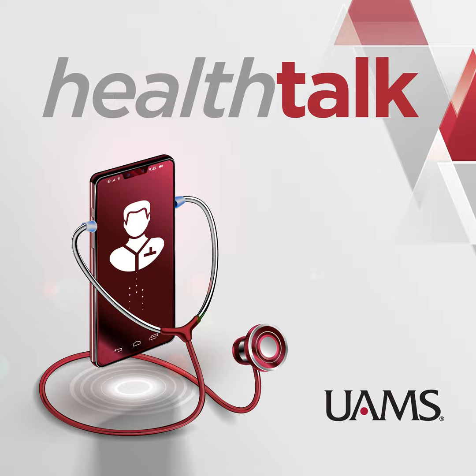We knew that there are a lot of patients who have painful diabetic neuropathy. Those patients, unfortunately, have tried a lot of medications. Those medicines have a lot of side effects, and often, even if the patient can get pain relief for a while, they may not stick with the medicine because of the side effects, or the medicine itself stops working after a while. And so knowing that we might be able to offer a non-pharmaceutical option that had some chance of affecting that pain based on some of the other information we had from the spinal cord stimulator experience led us to say, why shouldn't we try a high frequency spinal cord stimulator and see what the impact is on painful diabetic neuropathy?